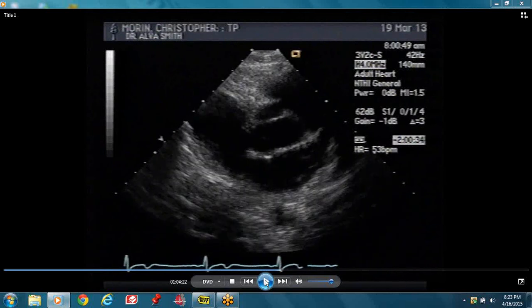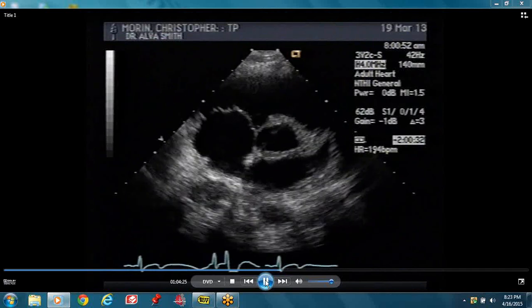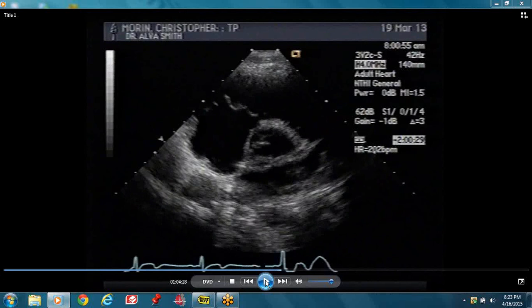Moving up to the short axis at the level of the aorta — the aorta is right there. In this view, you need to make sure that there are three leaflets. You have to look at your aorta. It's important that you look at the valve when it's open as opposed to closed, because when the valve is closed the raphé may give you an appearance of three leaflets when in actuality it's only two.